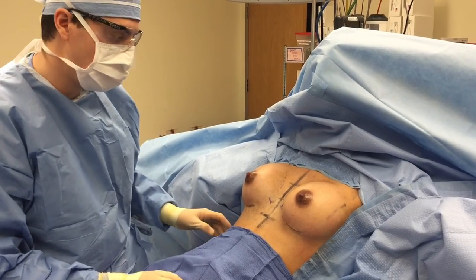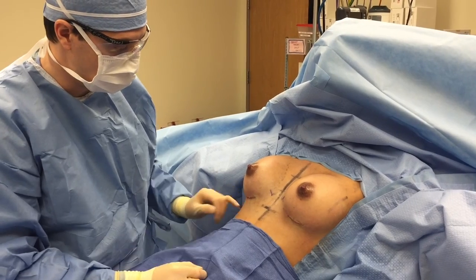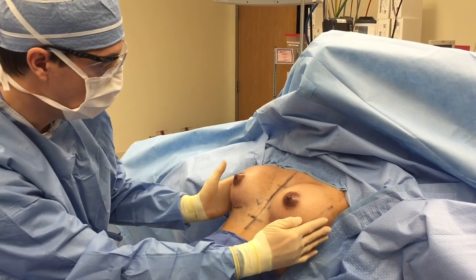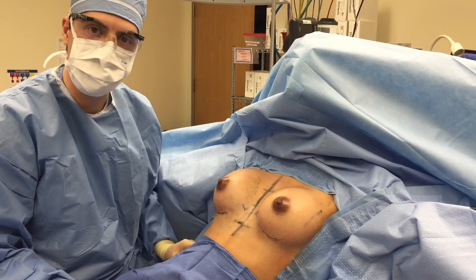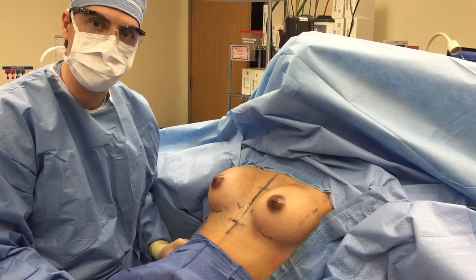We've completed the operation now. Her incisions have been closed underneath the breast. She has 345cc silicone implants under the muscle. As you can see, she looks symmetrical, nice shape, and she should be pleased. Visit our website at www.eaplasticsurgery.com for more pictures and videos.